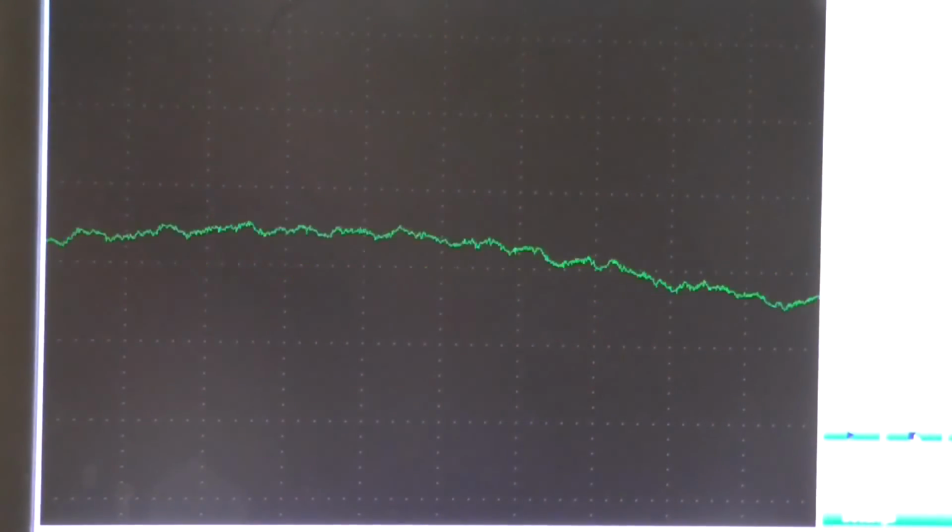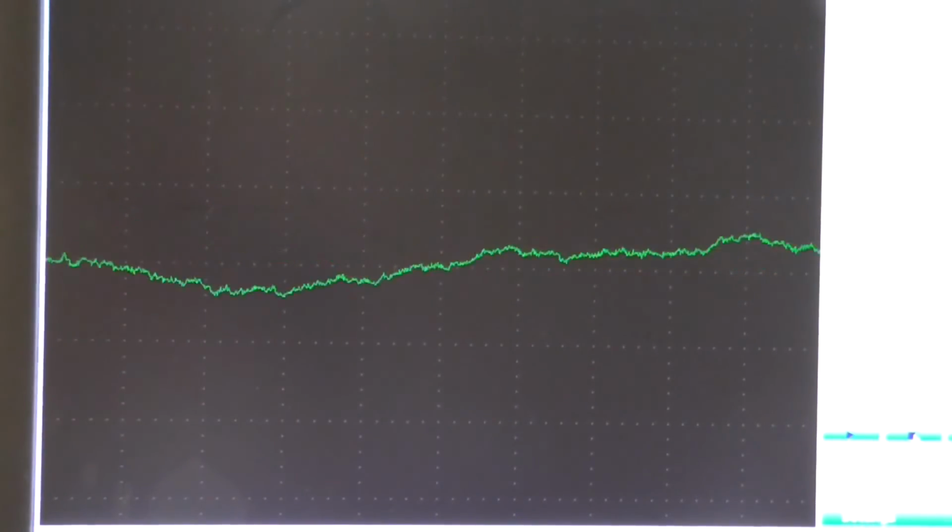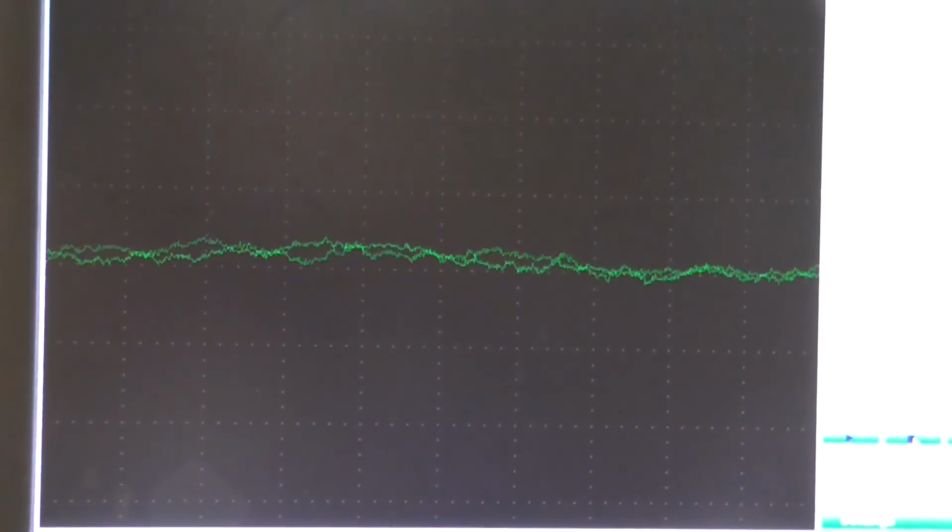Not only are there CRDs, there are also some fibrillations here as well, and I'm now going to show you the motor units too.